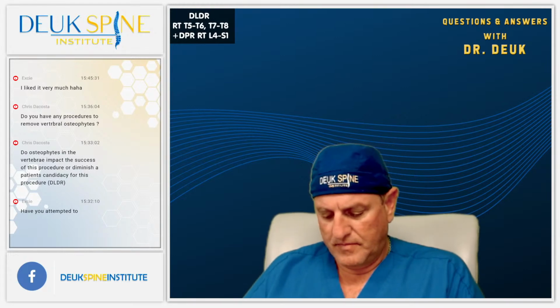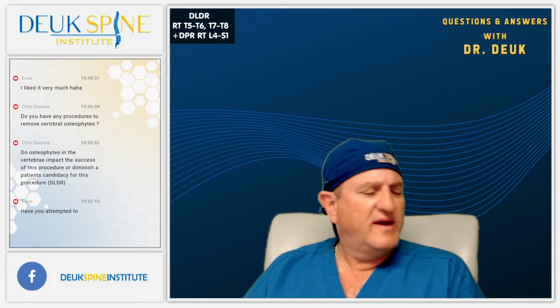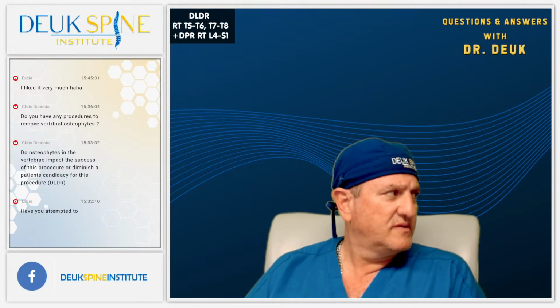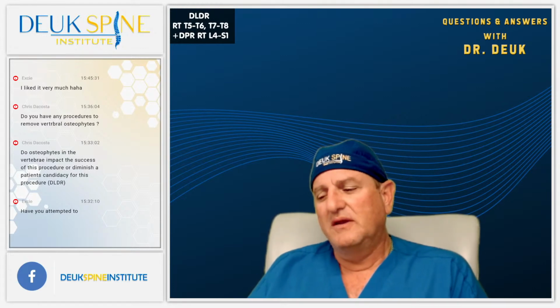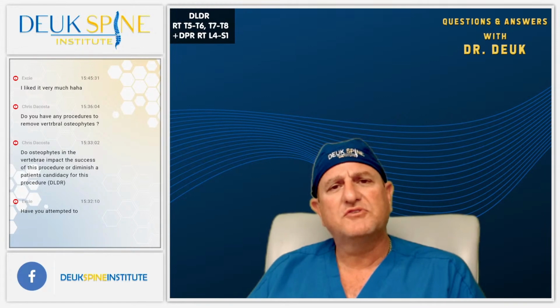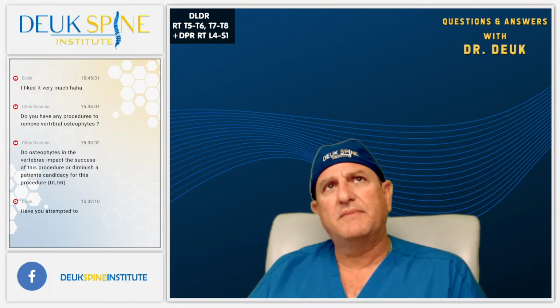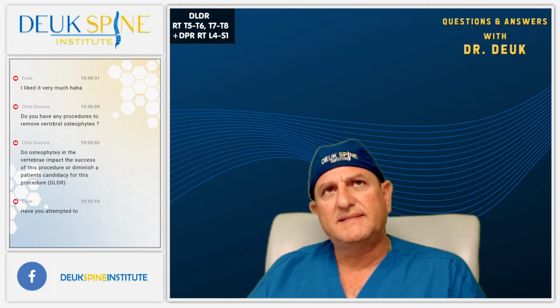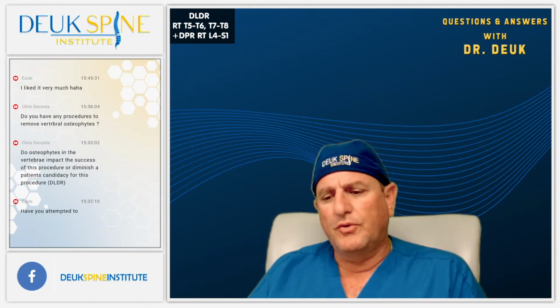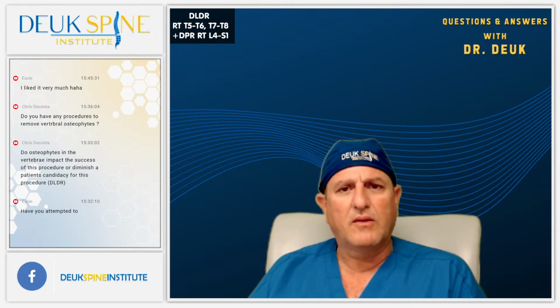And then last question from Chris asking, do you have any procedures to remove vertebral osteophytes? Yeah. So Chris, once again, the laser that you just saw removes osteophytes. The reason why we don't remove more osteophytes is it's not necessary to remove osteophytes. What can I make an analogy to? Let's say the battery on your car dies, and you go to start the car and it's not starting. So all you need to do is charge the battery or replace it, one or the other, but you've got to deal with the battery.